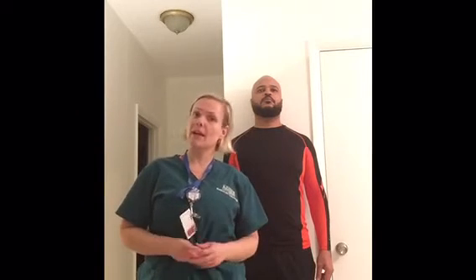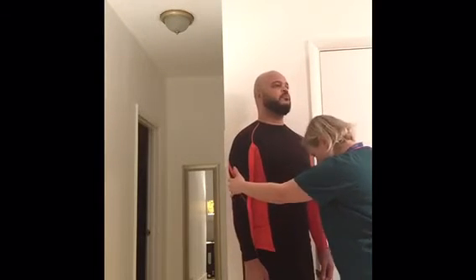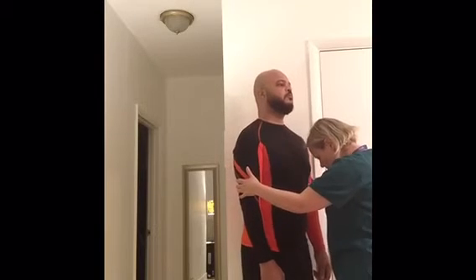And then we're going to do the oblique. I will do the LPO for the left posterior ribs, or the affected side. That will be the left posterior ribs that were injured or fractured. So I'm going to ask my patient to rotate a little bit towards me. It will be 45 degrees, so it should be a little bit there.